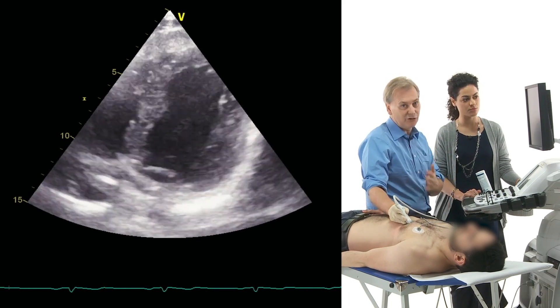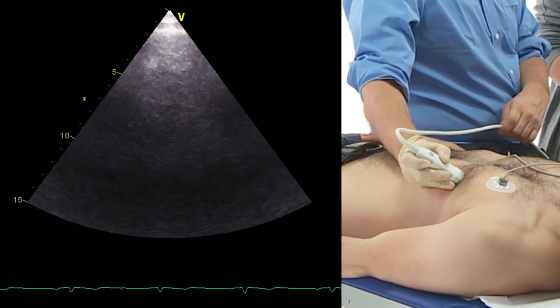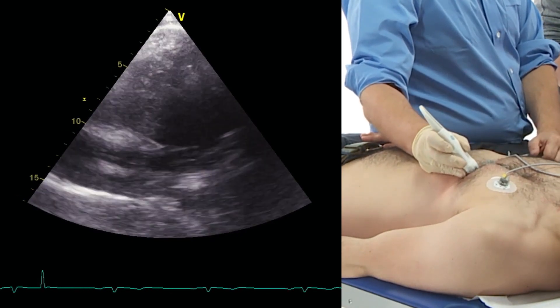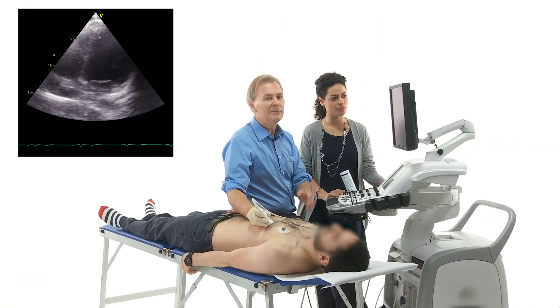In him I can show you can even get a completely normal four chamber view — almost a normal four chamber view if you're kind of on the rib. But just for demo purposes, in most patients you will have to be happy if you get something like that, lying on their back.